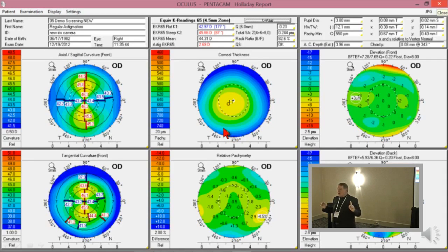Now, if you have a patient that's had myopic refractive surgery, and it's not in the last couple of years because we've worked out the optics to where it's a lot better, prior to 5 years ago, when we did myopic refractive surgery, the power of the cornea is not constant.